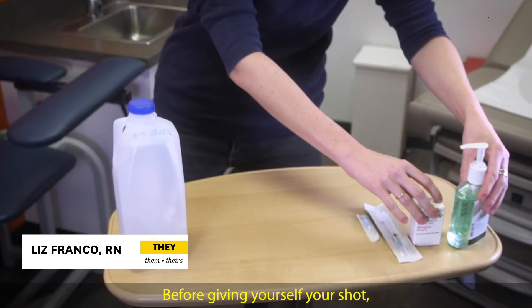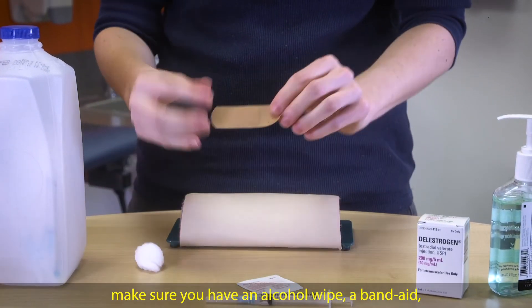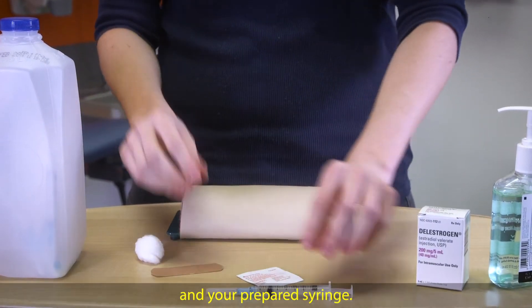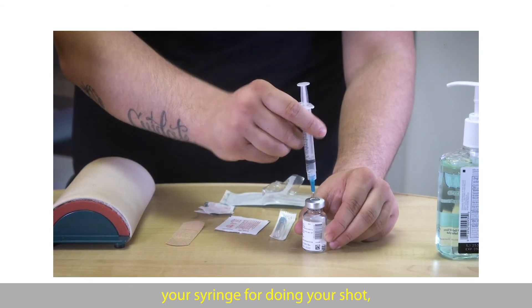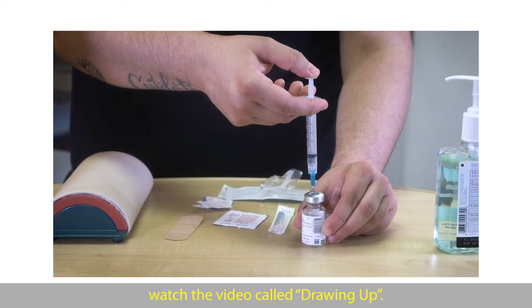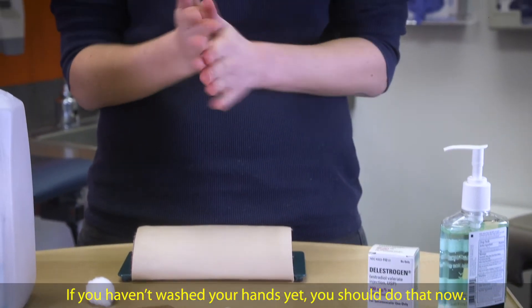Before giving yourself your shot, make sure you have an alcohol wipe, a band-aid, and your prepared syringe. If you aren't sure how to prepare your syringe, watch the video called Drawing Up. If you haven't washed your hands yet, you should do that now.